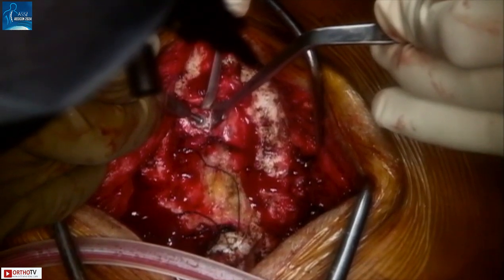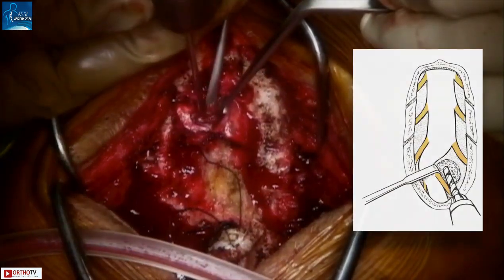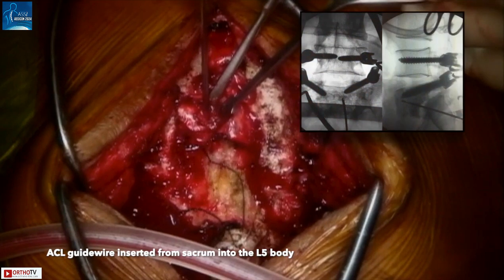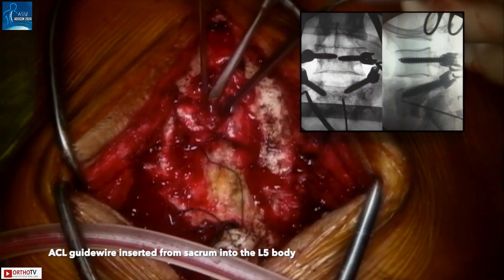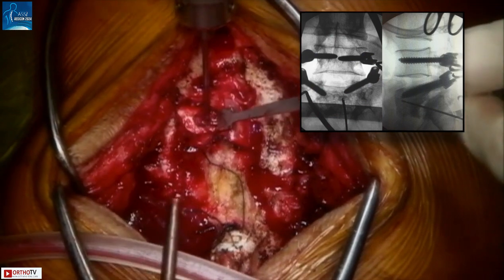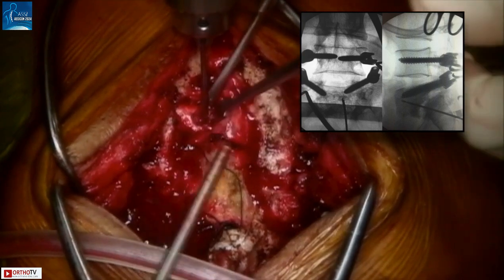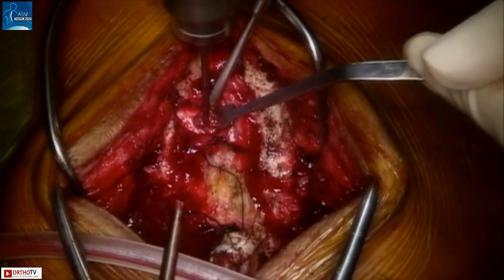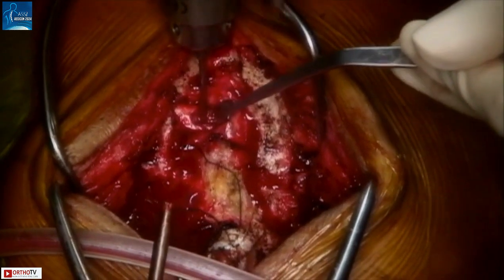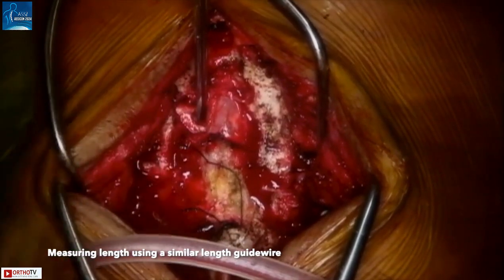A 3 mm burr is used to make a divot so that the guide wire does not slip. Then an ACL guide wire is drilled across from the sacrum into the L5 body. The guide wire should be directed towards the anterior superior corner of L5, done under fluoroscopic control. Both anteroposterior and lateral projections are mandatory at this step. Make sure you have adequate room around the guide wire to accommodate a 10 to 12 mm ACL reamer. A similar-length ACL guide wire can then be used to judge the length of fibula that will be required.